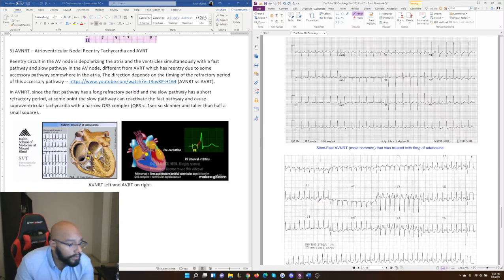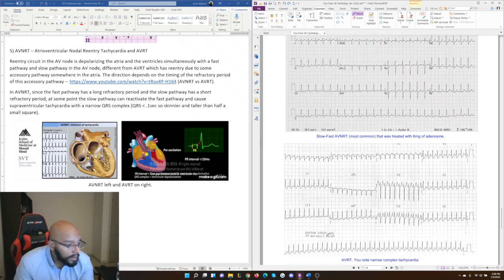For example, if we just look at the longest lead, just look at how it looks. It doesn't look as nice as it does here. You've got this weird curvature. It's not a sharp rise. Sometimes it is. This is a sharp rise. Sometimes it's not. It's got this curvature. And also you're not on the same line. The P didn't come back all the way because the QRS had already started going up. And so the P wave was supposed to go up and come down.